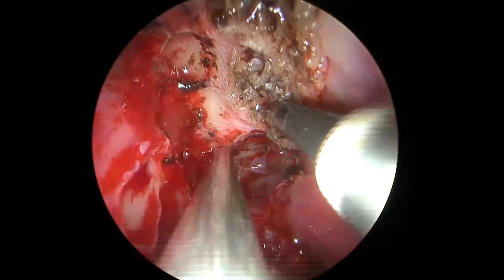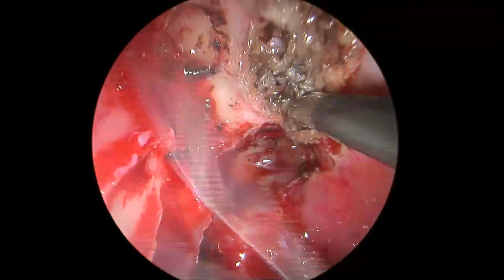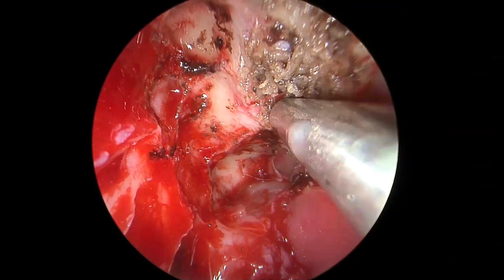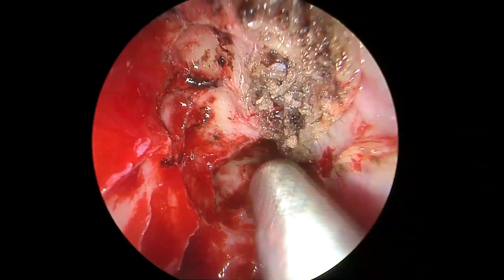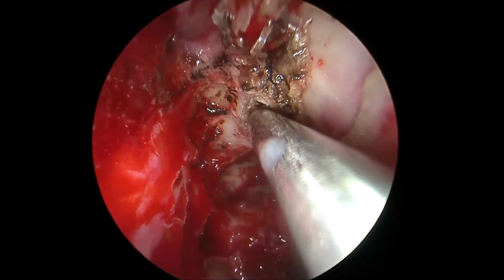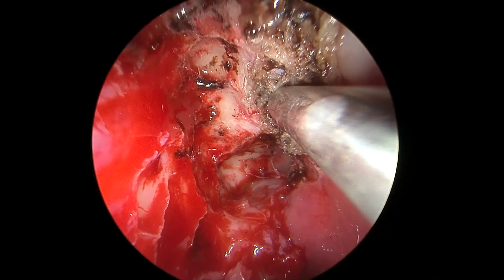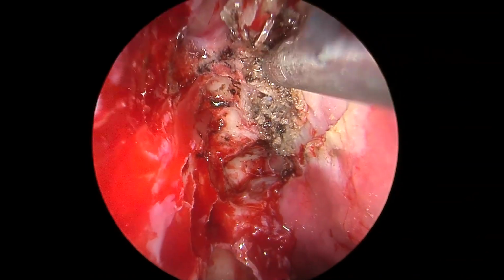Any excess mucosa and loose strands of fibrous tissue are best removed, because anything that protrudes too much will obviously affect your overall graft placement. It will not be smooth, the graft will not adhere to the bare bone around the defect, and that will always lead to suboptimal results and, in the worst case scenario, graft failure.